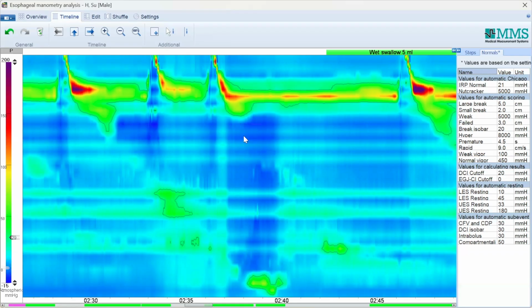We have to do it at the beginning, after calming down the patient to be comfortable for about 1 minute. Then we ask the patient to do the deep breath 3 times. Suppose we see that this line, the dark blue, goes from up to down and there is no increase in the pressure. That means the catheter is fully in the esophagus. It could happen because maybe the catheter is kinking in the LES and has not passed. So we have to make sure before doing the swallow.